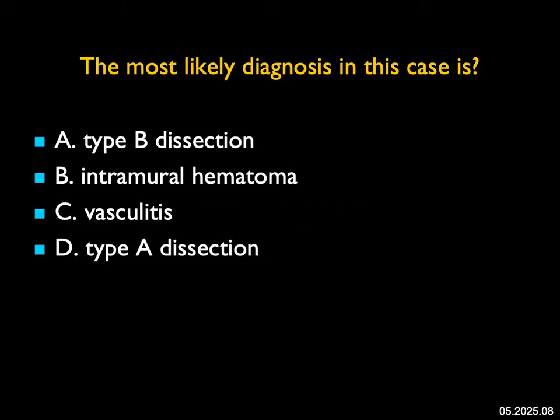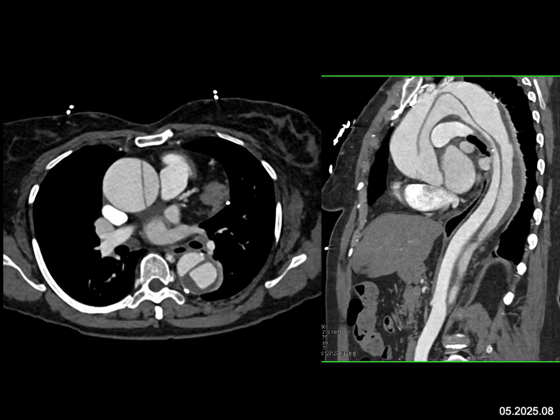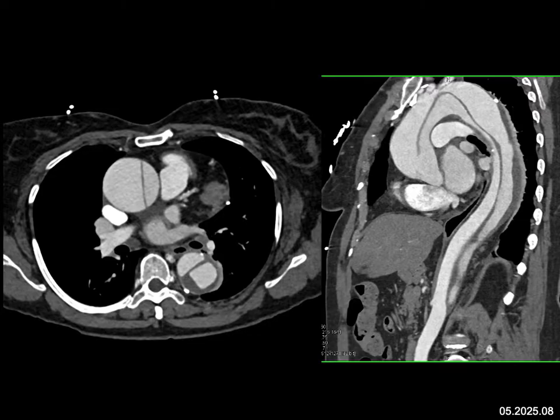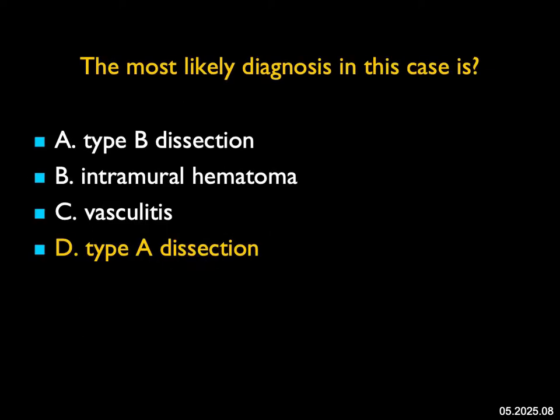The most likely diagnosis in this case: this is a very easy case. There's a dilated aortic root with a dissection in the ascending aorta, tracking through the arch and into the descending thoracic aorta and into the upper abdominal aorta. This is not the appearance of an intramural hematoma, and there's nothing to suggest vasculitis. It's not a type B dissection, which begins past the left subclavian artery. This is a classic type A dissection beginning above the valve leaflets and above the coronary arteries.